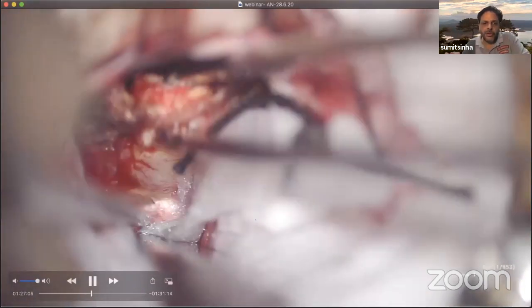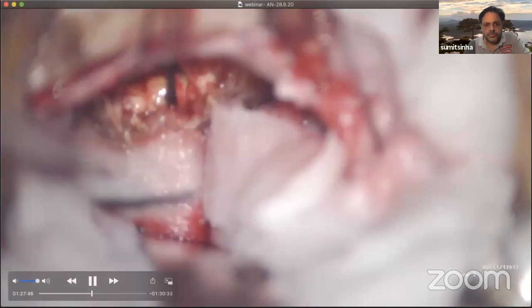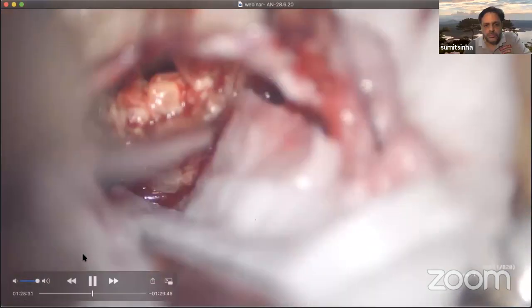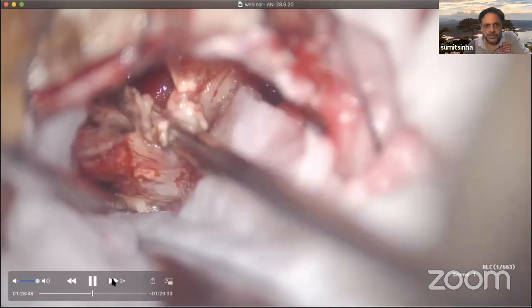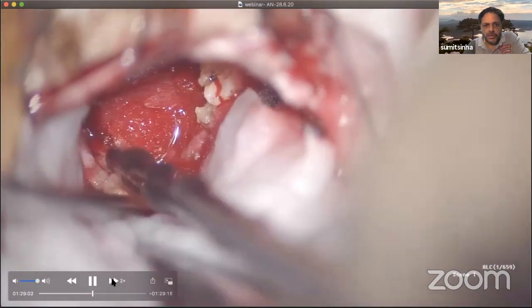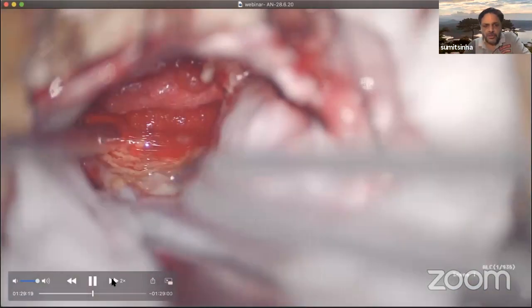So you lift the tumor capsule from the brainstem and then slide the cotton patty between the arachnoid and the tumor capsule. Taking this whole capsule out so that the tumor becomes more manageable, easier to handle as compared to what it was. So making the tumor small, so that it is easier to handle and easier to dissect from the surrounding structures. This is the strategy.